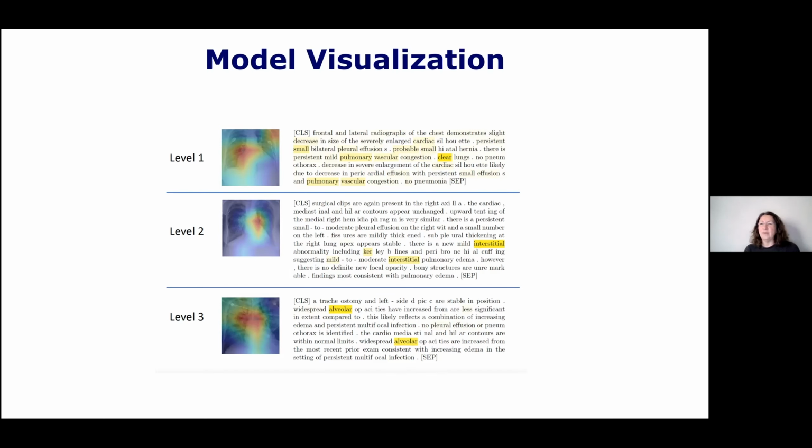And in particular, what I will do is I will take that joint representation, and instead of highlighting parts of lung, as you can see on the left, or in addition to highlighting parts of lung, I can also highlight sentences or words in the text that triggered the decision or affected the decision the most. And at least anecdotally, by showing this to our clinical collaborators, it seems like there is a lot of evidence that this is a very useful model. We are currently investigating further directions of further research into providing supporting evidence for models like this.